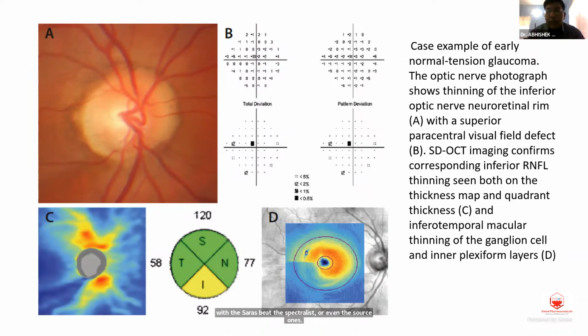Now, this is what we are talking about. Whenever you are taking an OCT, it has to be in tandem with your fundus finding and your perimetry. Just as in this case, if you go in a retrograde fashion, there's an inferior defect, perimetry shows a superior defect, and the GCC count is also reduced. So all those things should be correlated, and they should not be taken in silos. You should be taking all these things into account to put forth a diagnosis.